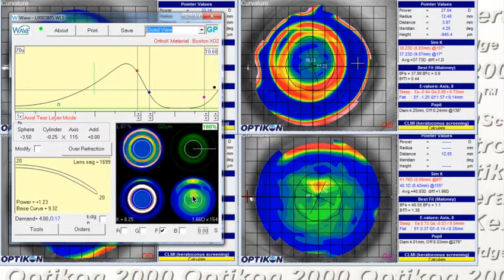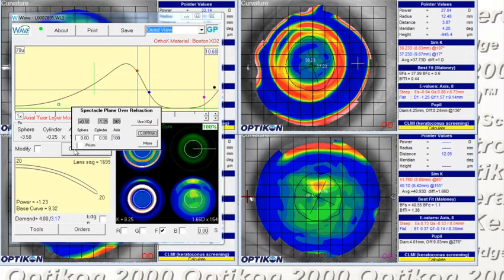However, in this case, we actually don't want to do that because we need the patient to retain this cylinder on the cornea so that it cancels out the cylinder that's inside the eye on the lens. A good way to look at that is to click the overrefraction box, and it predicts about a diopter and a quarter of against-the-rule astigmatism if we do sphericalize the cornea.